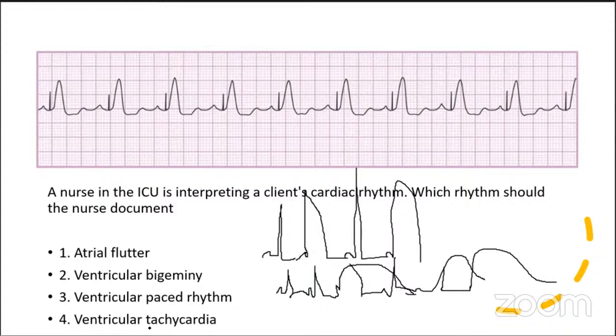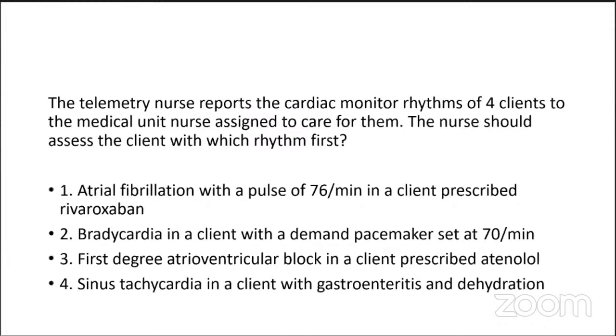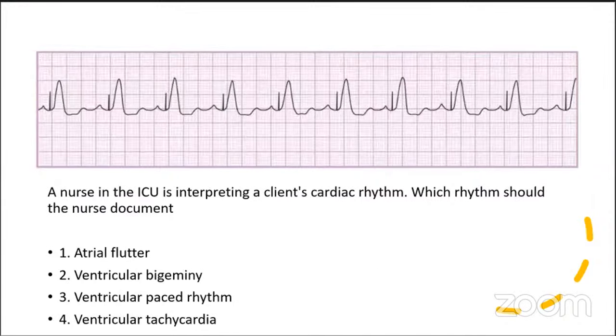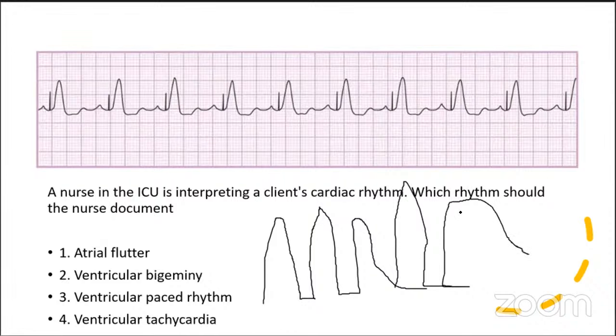And then we already talked about ventricular tachycardia. So again, with ventricular tachycardia, just to mop it all up, you're going to see a rhythm that is fast. So let me just draw this. I'm struggling with my pen. I need something I can write with instead of my mouse. So again, we're going to see wide complexes, and they're going to be close to each other. Again, I said most times you can just look at the rhythm. Just by looking at the RR interval, you can tell if the rhythm is fast or slow. See how close these two are together. If they are close together and the rhythm is fast, I call it a tachycardia.